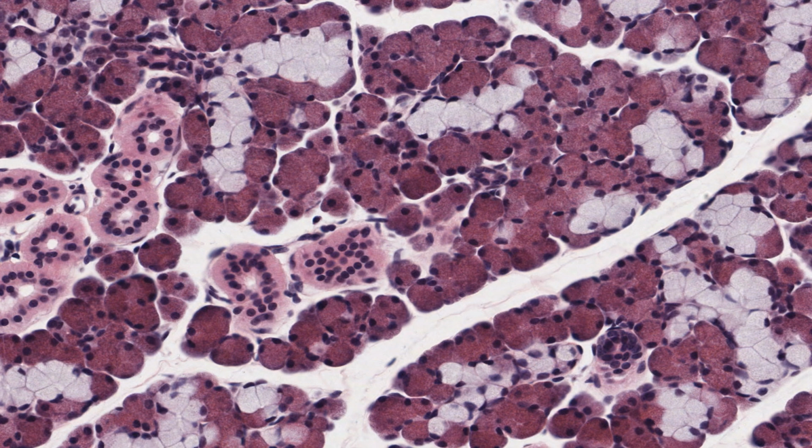Most of the serous secretory units are spherical acini, but many of the mucus units are branching tubular, with a swollen acinus or alveolus at the end. Actually, most compound glands are tubuloacinar, with the parotid salivary gland and the pancreas being exceptions.